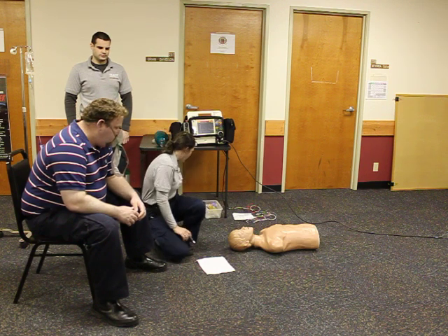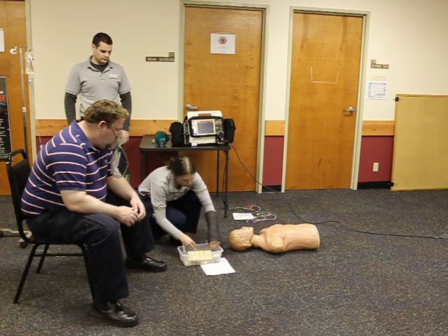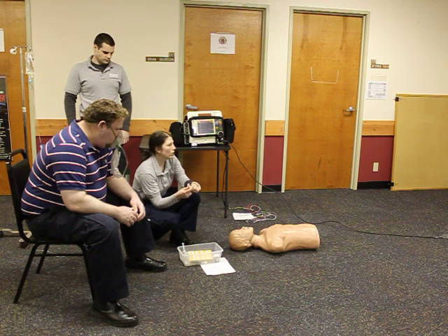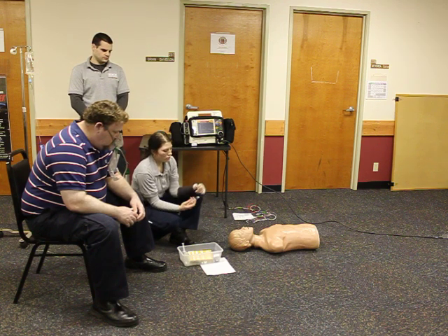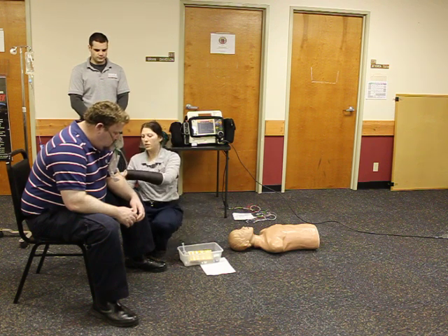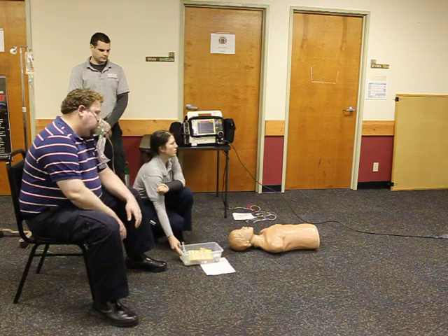Since that did not work, I would like to go to adenosine. My first dose is 6 milligrams, so I'm going to draw it up, making sure that I have the right patient, right medication, right dose, right route, right time, and right documentation. I'm going to draw it up, making sure that it is 6 milligrams of adenosine. Going to administer it fast IV push, followed by normal saline bolus.